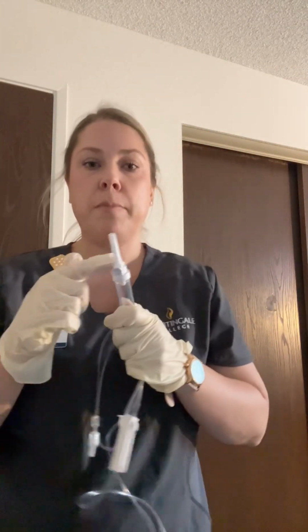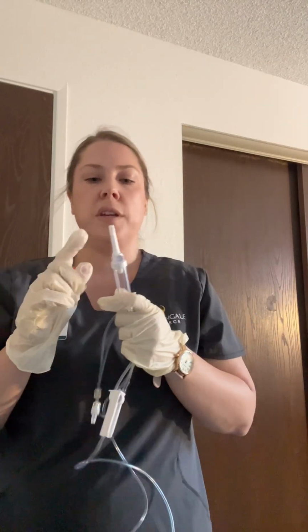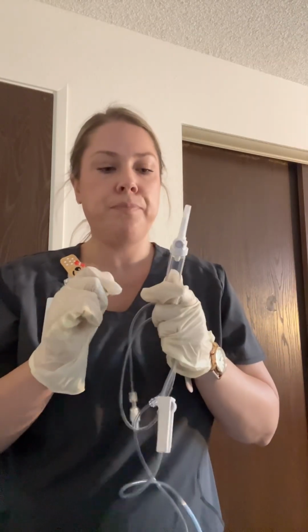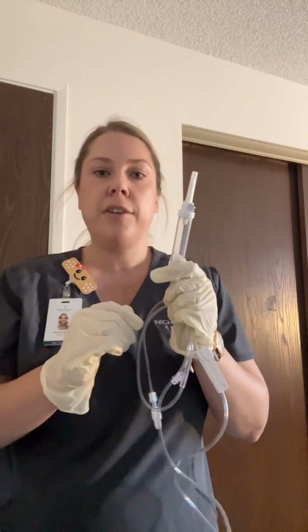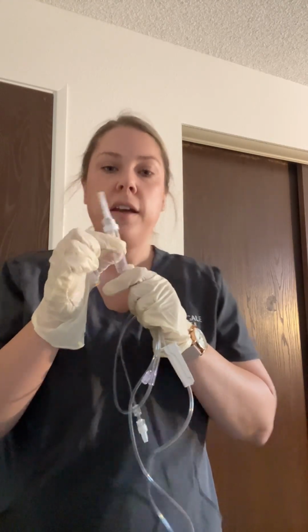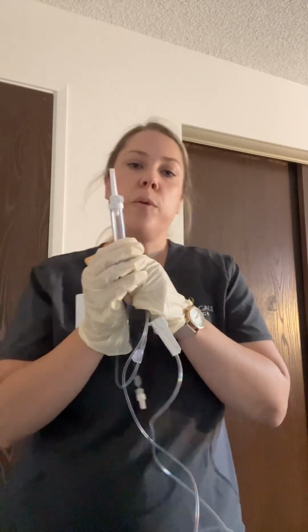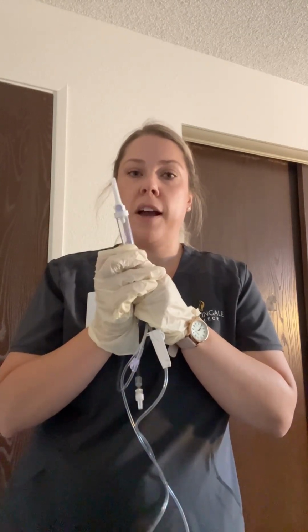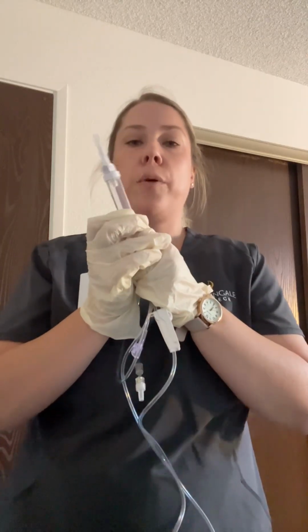For our primary tubing, we have our spike here. This is a cap on it. We want to keep this cap on to keep it sterile until we are ready to use it. Next, we have our drip chamber. This we want to fill up halfway, and this is where we will also reassess our drop factor to make sure we have the correct counts.